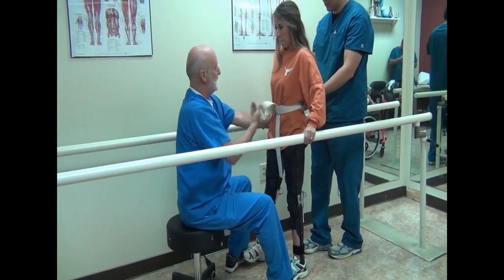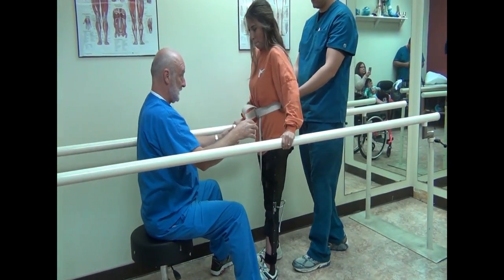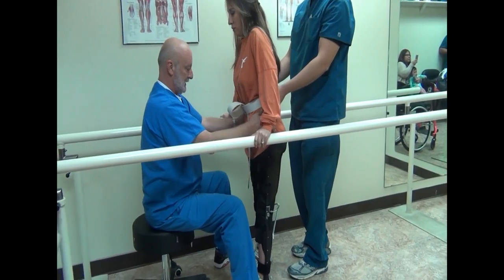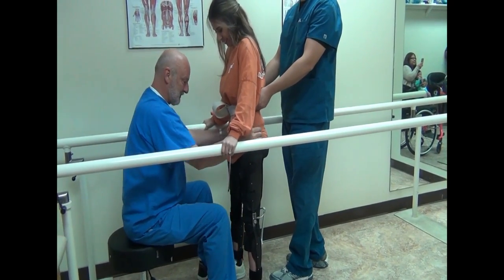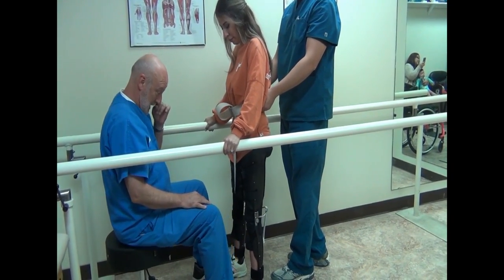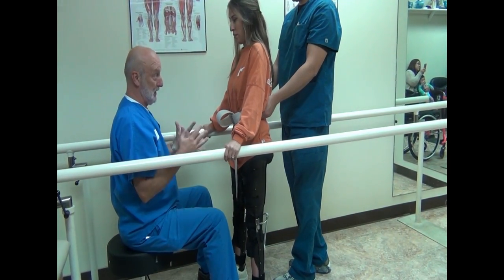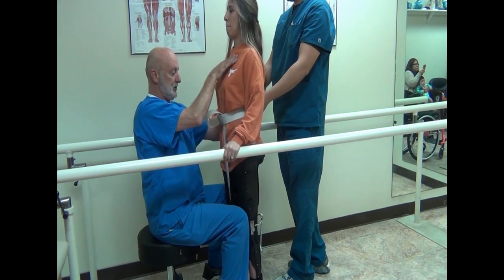If you're putting your legs way out in front of you, I'd like you to come forward over your legs, and you've got to stretch out those reflexes. Shift your weight. Come forward with this leg. What does it feel like to you? It feels like I just need to get used to it — it's just new to me. Good. Now we're going to turn around. Are you getting therapy? Do you have a place with parallel bars? That's where you want to practice to get good. Then you can go to forearm crutches — they're going to be the way to go. You really want to get to where you can shift your bottom forward so you're stable.